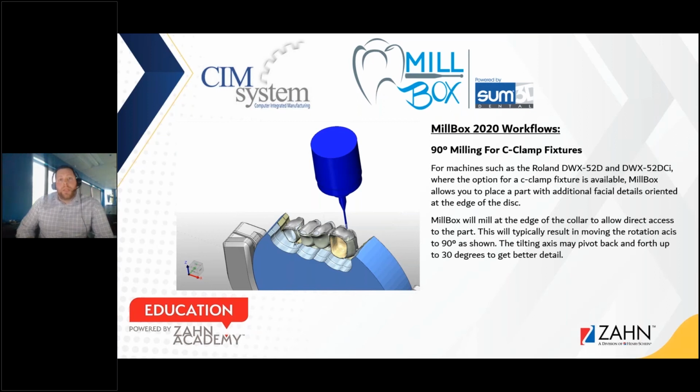And this is huge because it's only available on certain mills that have the C clamping feature. Some of those mills that we can speak of are the Roland 51D, the 52D, the 52DC, and the 52DCI. Those all have the capability to have the C clamp fixture integrated into that mill, so we can go ahead and utilize this feature.